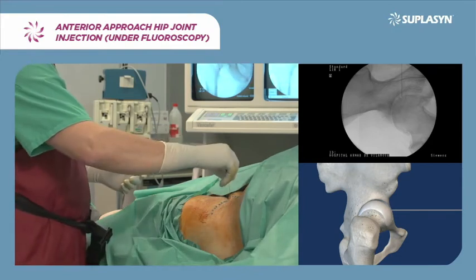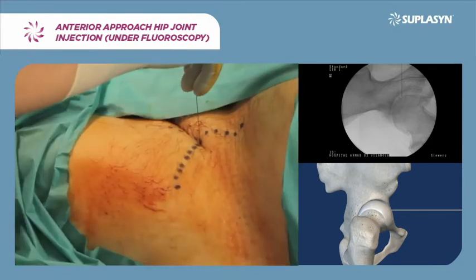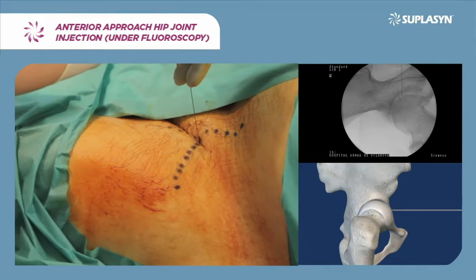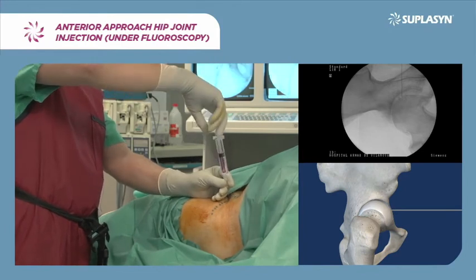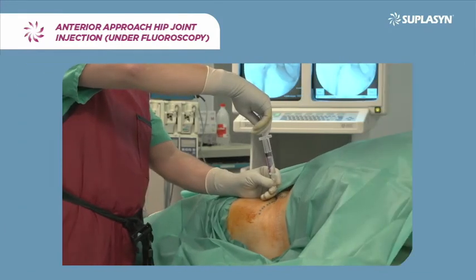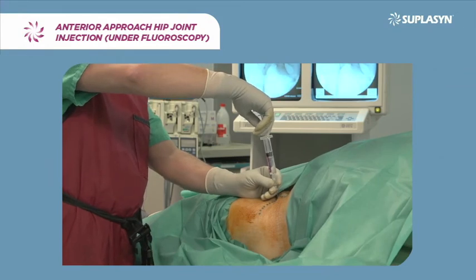Fluoroscopy is used for guidance in properly targeting the needle, and insertion is continued until contact with the joint capsule is perceived as a slight elastic resistance. Once at this point, aspirate prior to the hyaluronic acid injection for its diffusion in the joint.